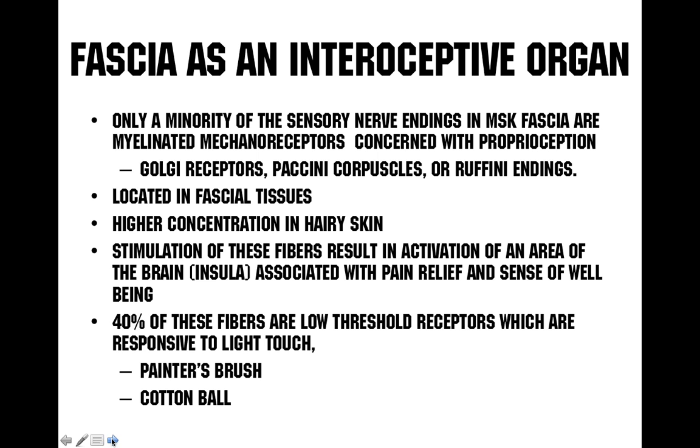So if somebody's coming in with pain, it would be smart to mitigate their pain softly first before you take a tool and cause them to sweat on the table, cause their eyes to dilate heavily, cause them to feel nauseous, all types of signs and symptoms that may be caused by over-treating the nervous system. And for years I've taken tools and induced so much pain for people that are already in pain, it just doesn't make any sense.